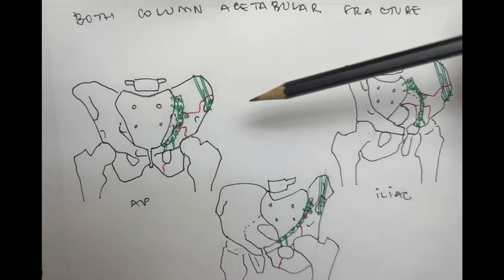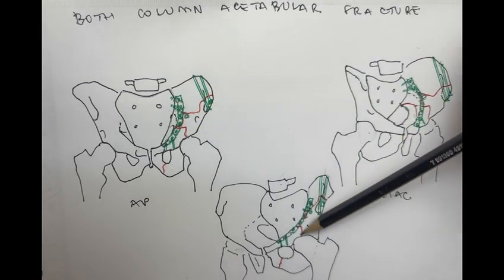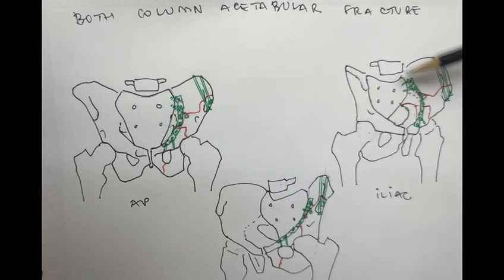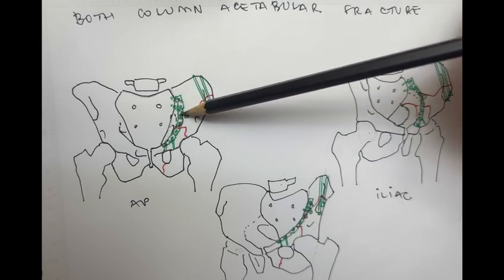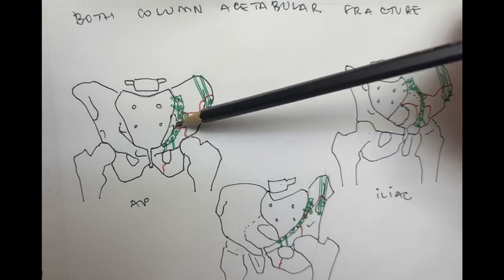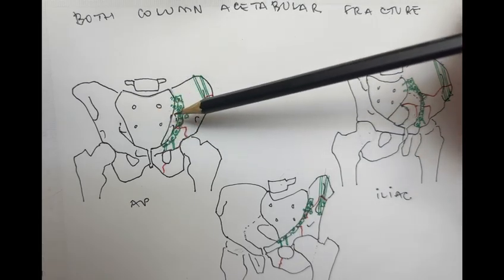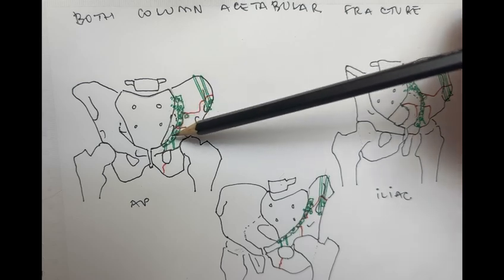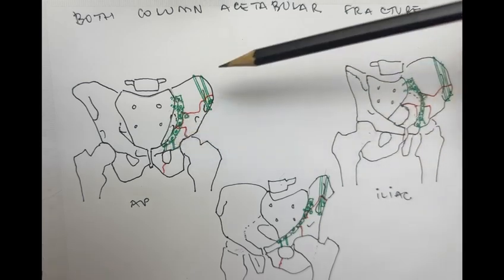So the next step would be reducing the other areas of the anterior column, like here, for example, and then sliding a plate here from this area, just lateral of the SI joint, going all the way behind the iliopsoas and femoral nerve and the vascular bundle, and the spermatic cord if male, or the round ligament in females, and coming to this area where we have solid bone and applying at least 2 screws.